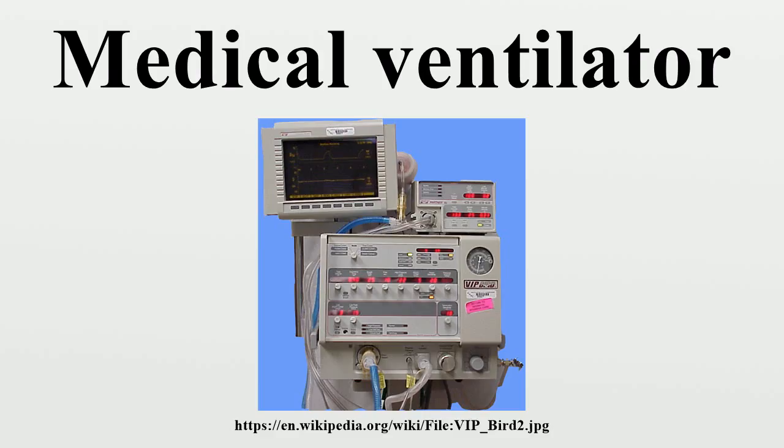In the United Kingdom, the East Radcliffe and Beaver models were early examples, the latter using an automotive wiper motor to drive the bellows used to inflate the lungs. Electric motors were, however, a problem in the operating theaters of that time, as their use caused an explosion hazard in the presence of flammable anesthetics such as ether and cyclopropane.